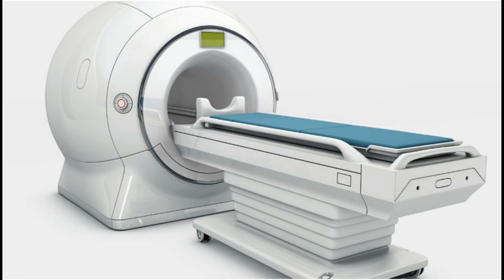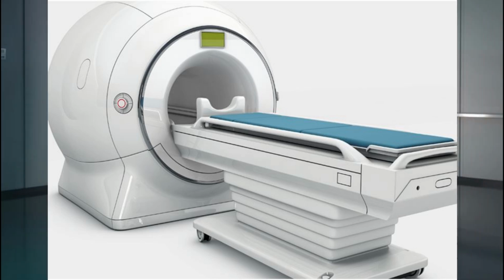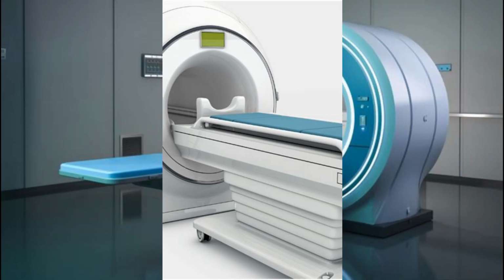A variety of techniques can be used to generate the pictures, such as administration of a paramagnetic contrast agent, gadolinium, or using a technique known as flow-related enhancement, example 2D and 3D time-of-flight sequences, where most of the signal on an image is due to blood that recently moved into that plane. See also FLASH MRI. Techniques involving phase accumulation, known as phase contrast angiography, can also be used to generate flow velocity maps easily and accurately.